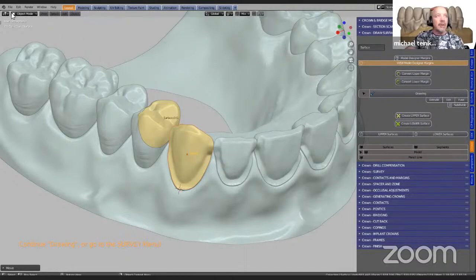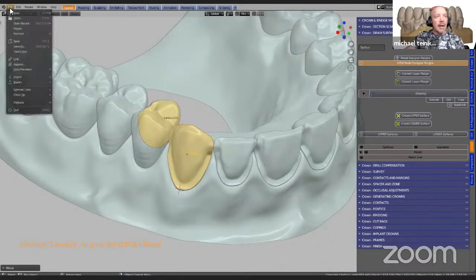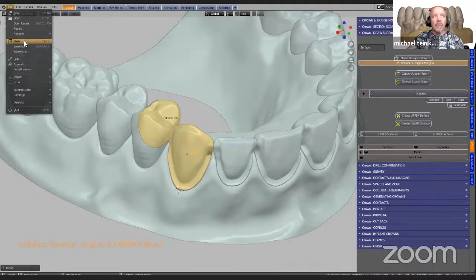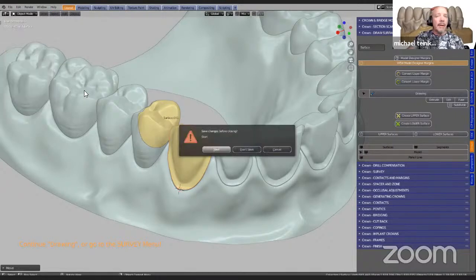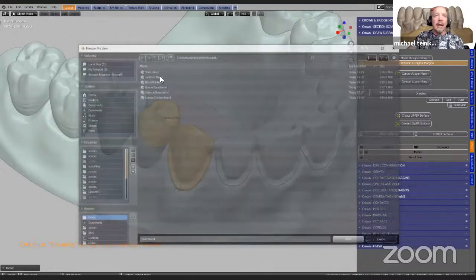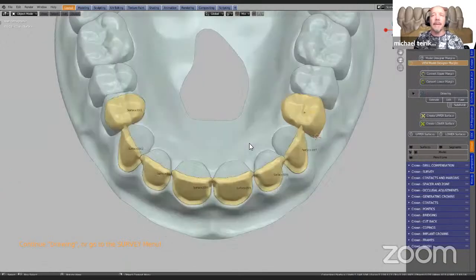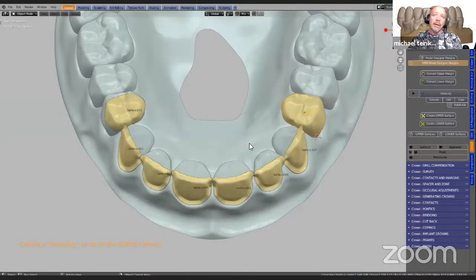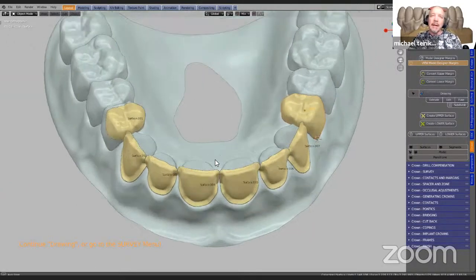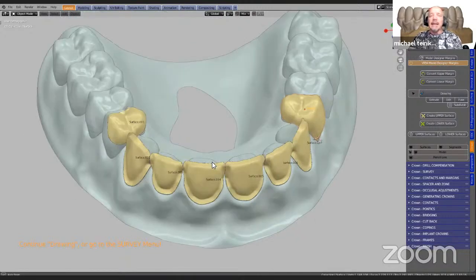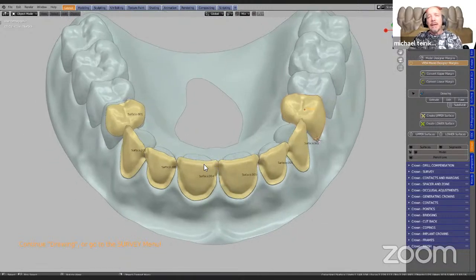Just to cut down and make it a little bit more efficient, I'm going to open up the next file, which will then have that stage completed. Here we see all of the surfaces that have been done. The next thing is we need to block these out.